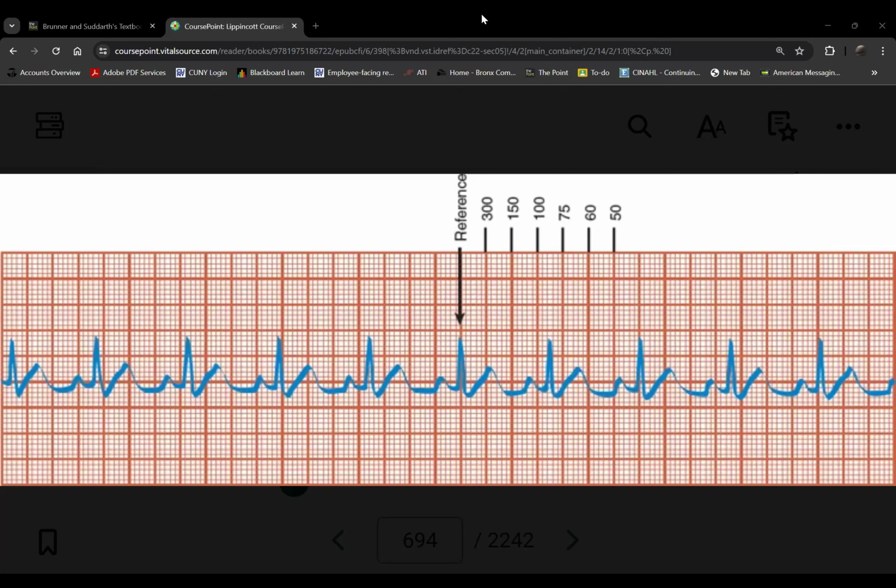300 big boxes divided by 3.5. So about 86, yeah? So is it different from what we counted from the first method? About the same, yeah? So we got the same answer. All right, let's try the small boxes method. Let's try 2 different R's.